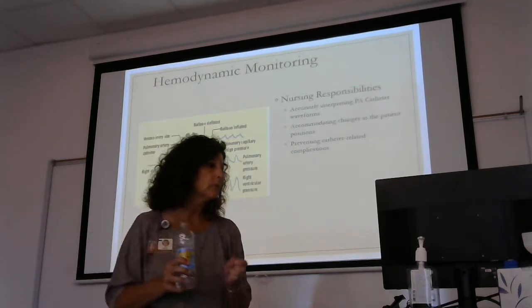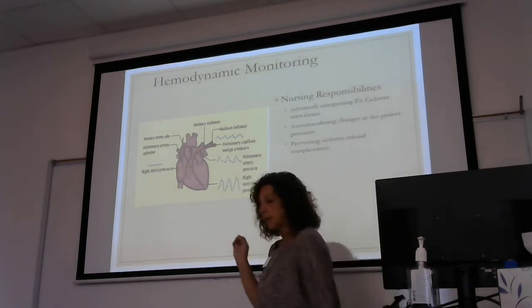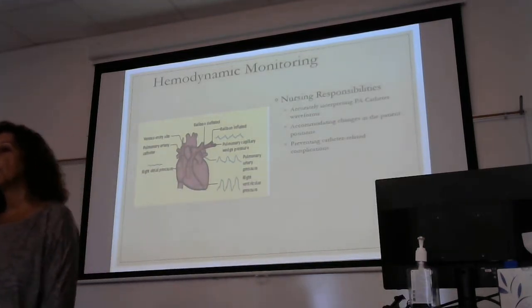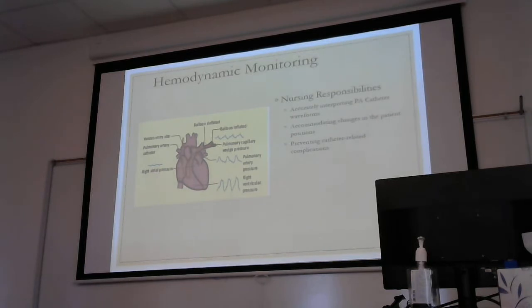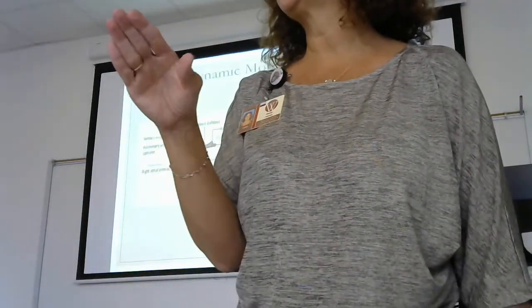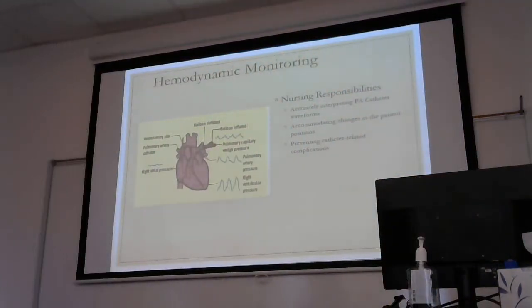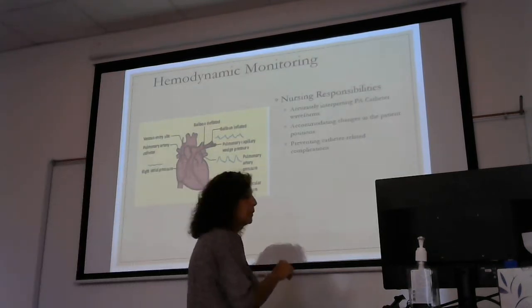But when we're looking at our waveform here, I'm knowing what I'm talking about, and I'm looking at a waveform. When you were on the floor working with that patient with their oxygen saturation monitor, and that waveform was really, really dampened, were you really trusting the values that you saw? Not real comfortable that that's really legit, because it's not sensing appropriately. And likewise here, I should see certain distinct types of waveform on my monitor letting me know that this number is more reliable. So let me give you some better pictures in here.